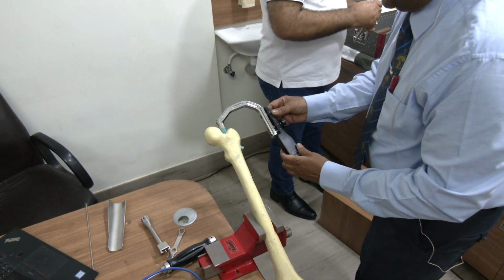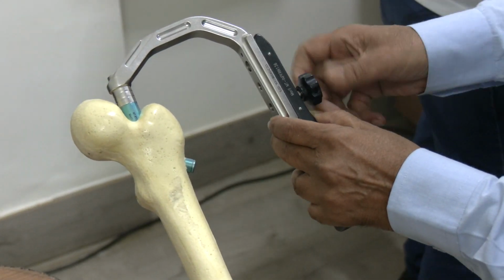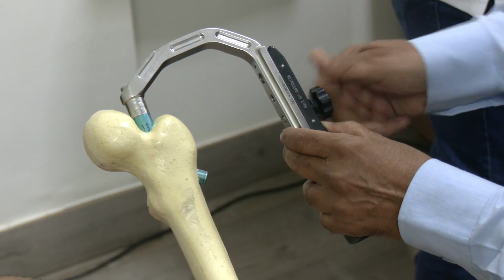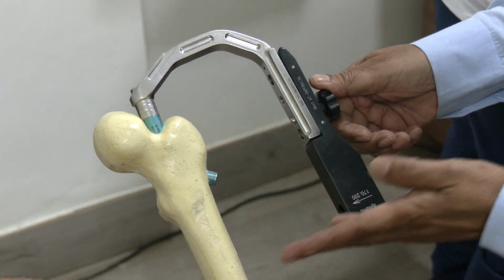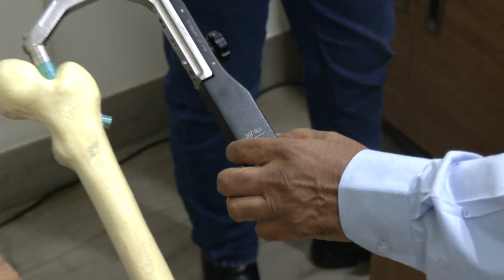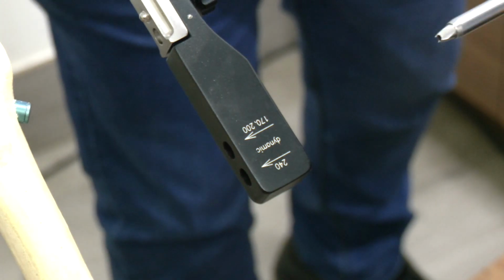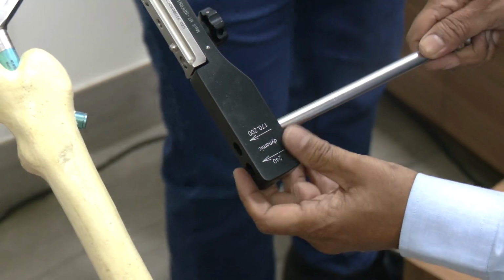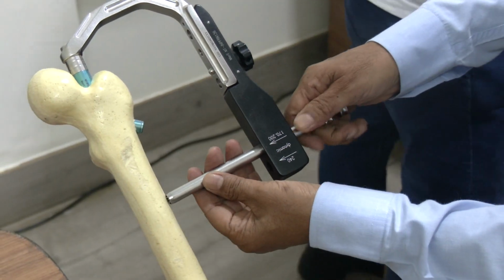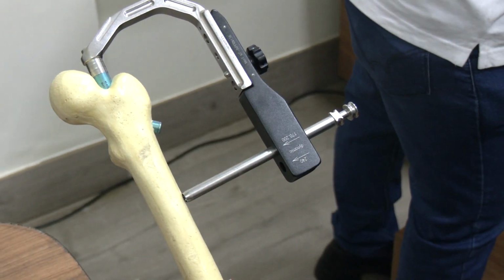So I am attaching now the dynamic locking jig. Here in the dynamic locking jig, you can see that the hole is parallel. We have used a 200 millimeter nail. So we will drill for the 200 millimeter hole.